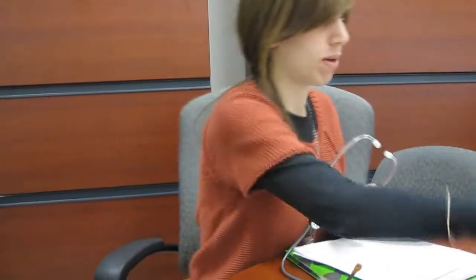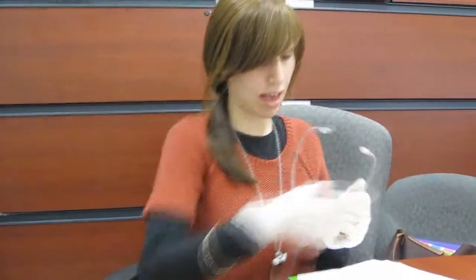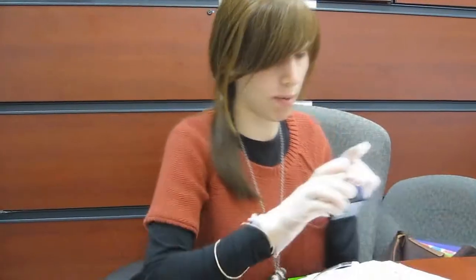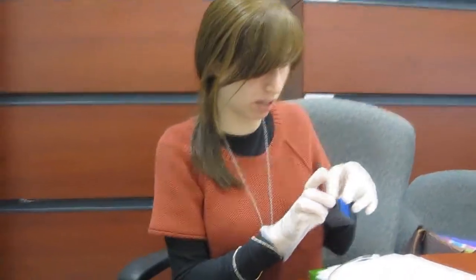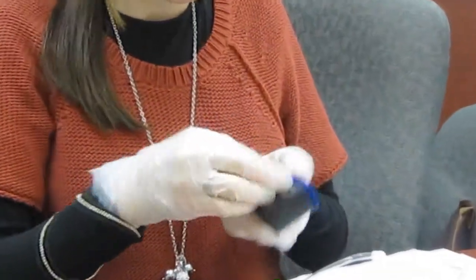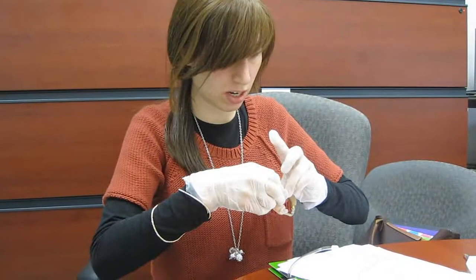Okay, now we're going to do the battery check. So we're just going to wipe this off. Before we do that, we're just going to take the battery out to actually check if the battery is working. And we're going to put it in the correct hole over here. And then we press this and it shows good, so we know that the battery is working. And now we're going to put it back in here.